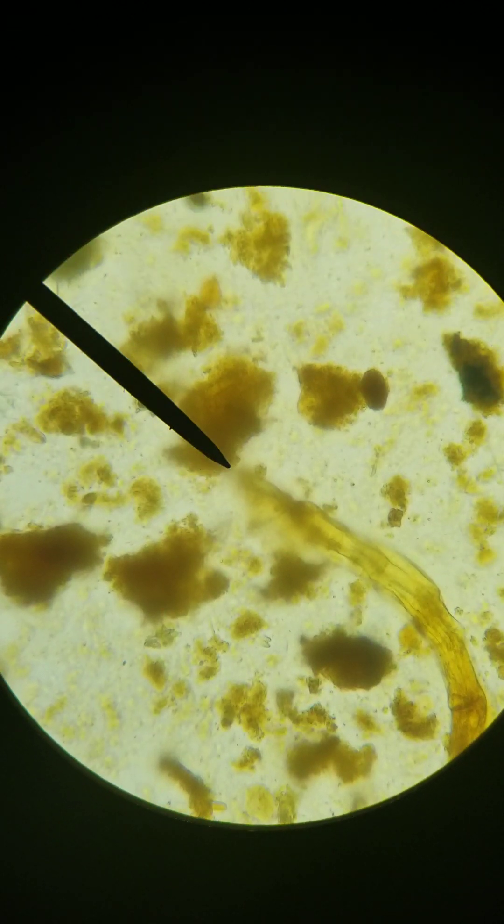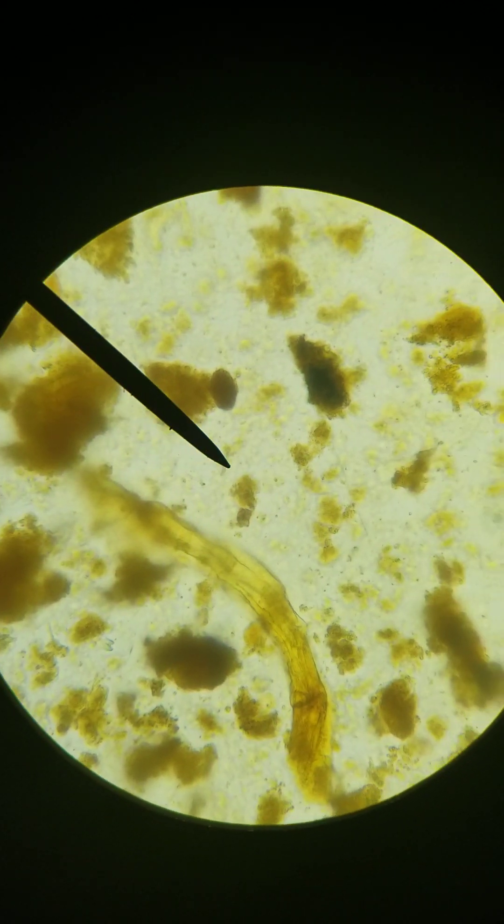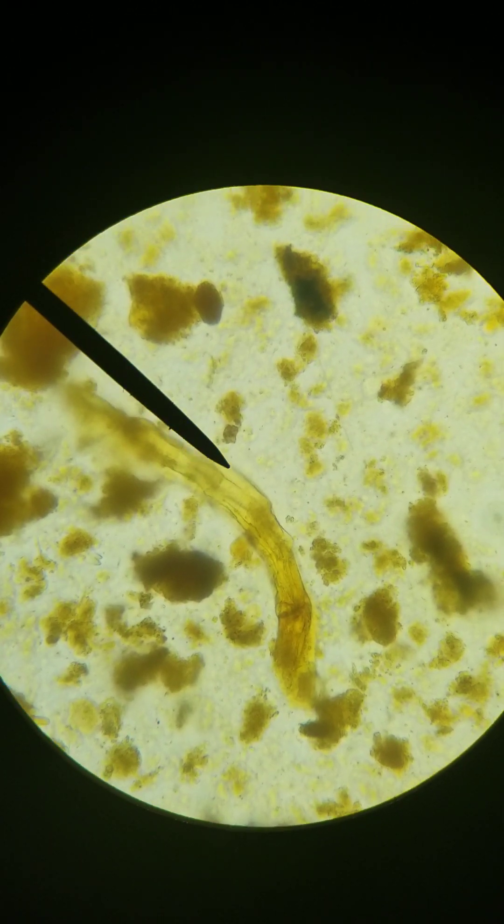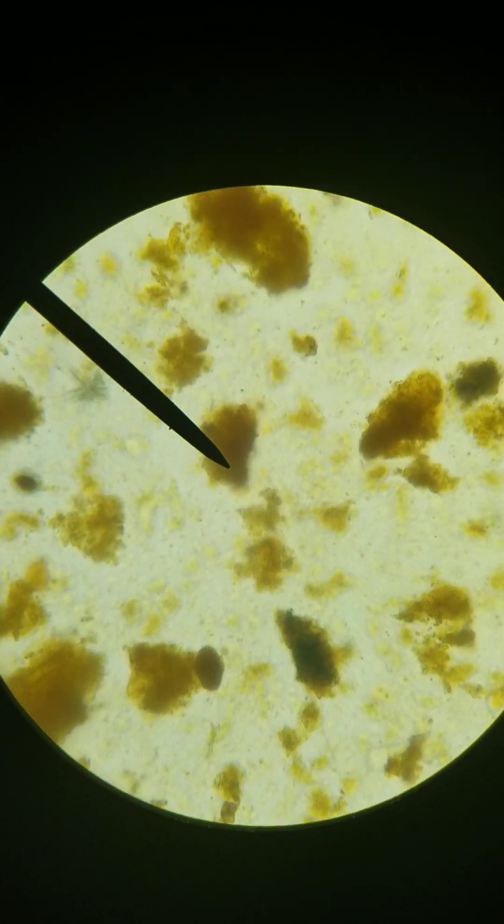That's again not a worm. Worms have beautiful, smooth skin — and that is not.